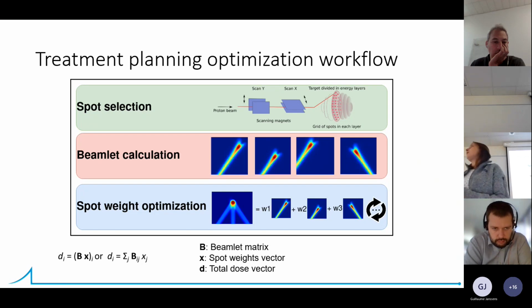How do we do this? We use a dose engine that is MC square. Actually, it was written by Kevin Souris. And so this MC square engine will simulate the interactions of protons in the patient and will score the deposited dose in the spots.